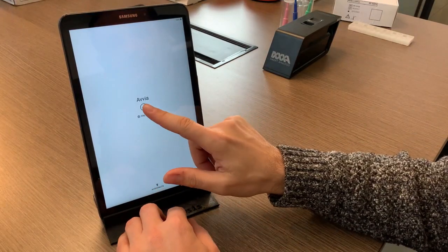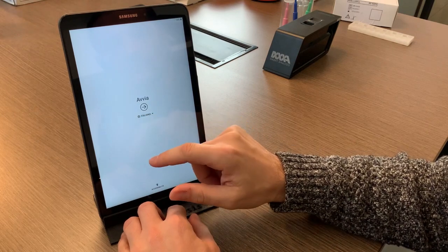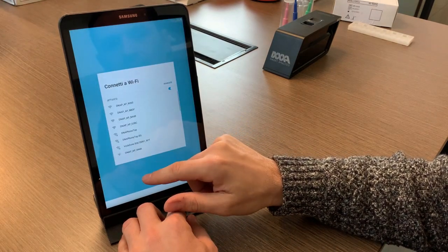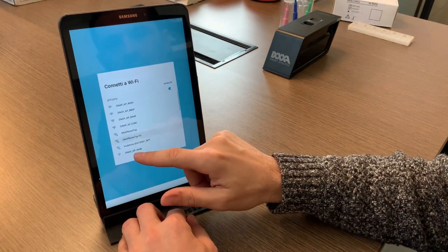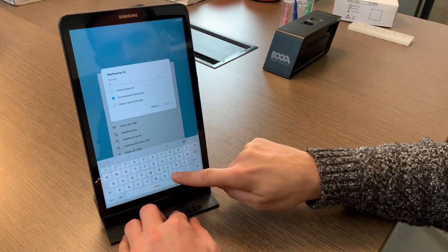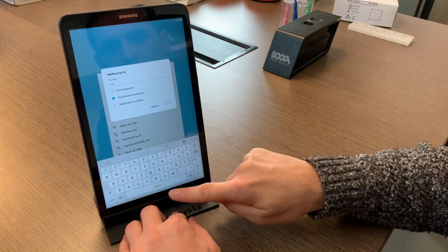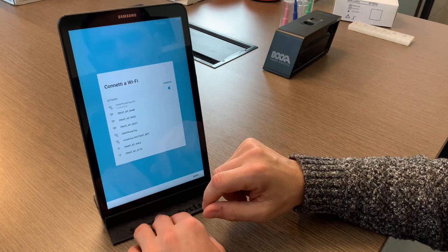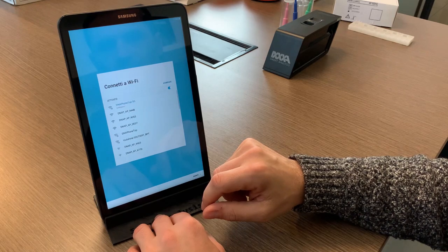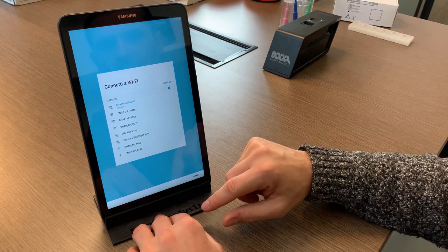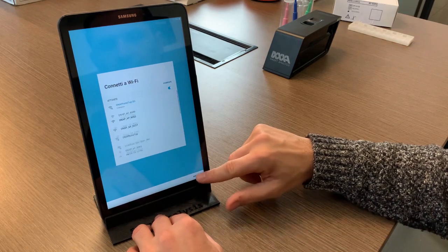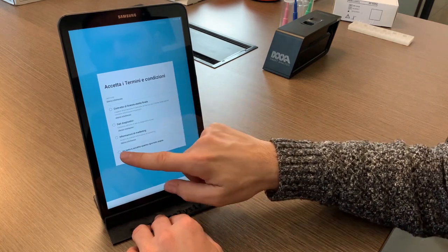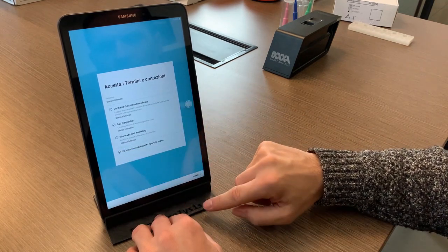Start the tablet. The first thing you have to do is connect it to a Wi-Fi network. Once you have connected to a network you have to accept all the conditions and enter a Google account. The Google account can be one you already have or one you can create on the spot.